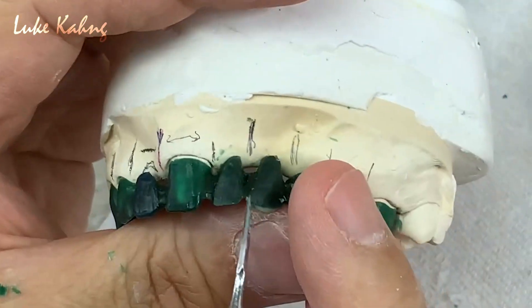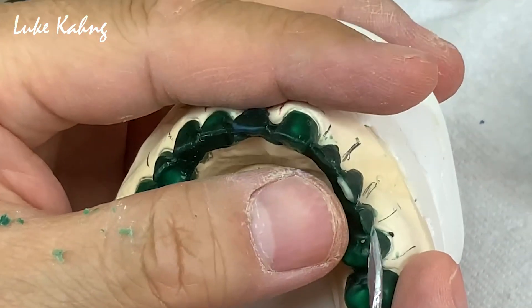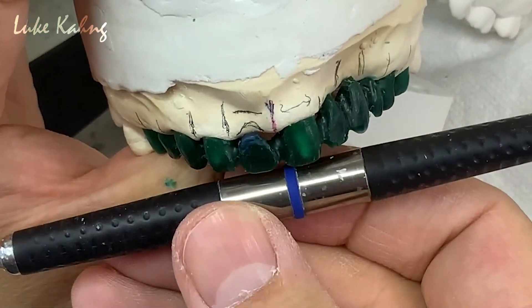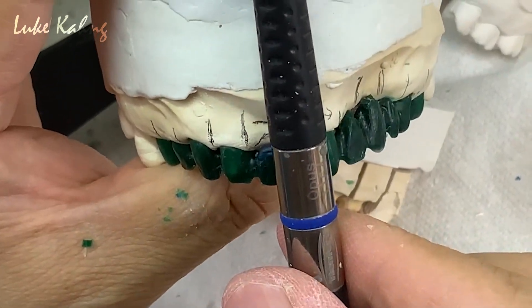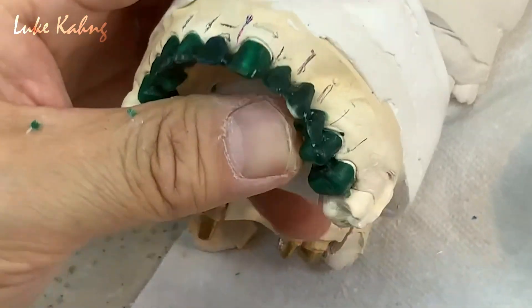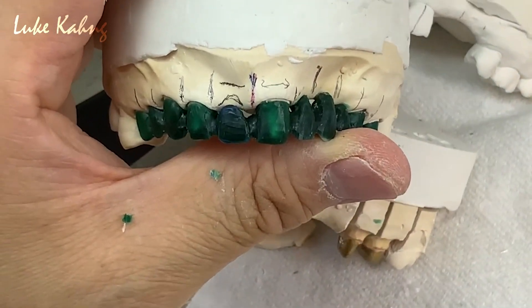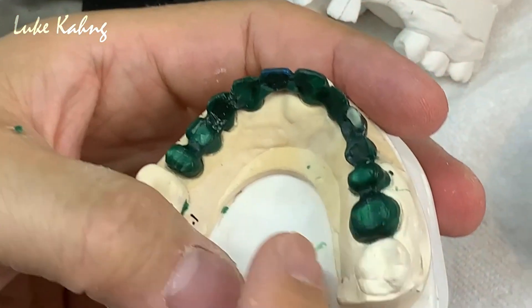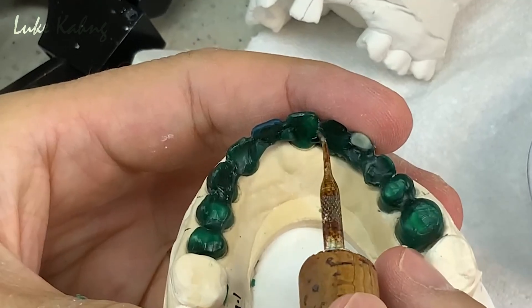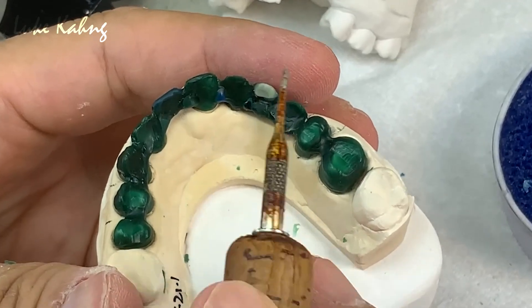When you have something sticking out, you have to control the facial thickness. Here is the horizontal, here is the vertical — take a look at it. Just a little bit longer, matching this compared to what I'm achieving. I like this. I want to make it a little bit thick.